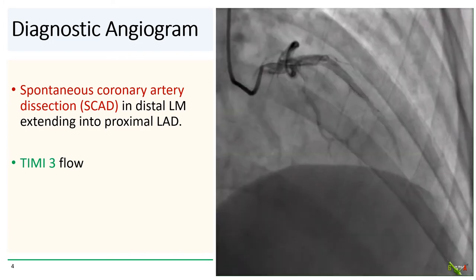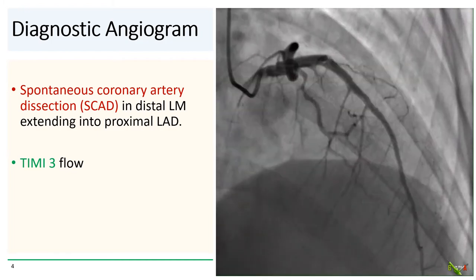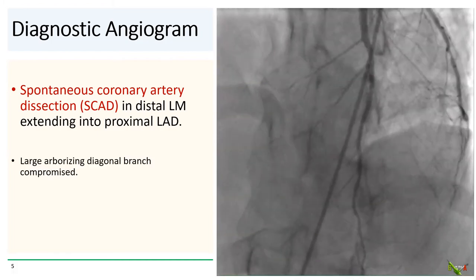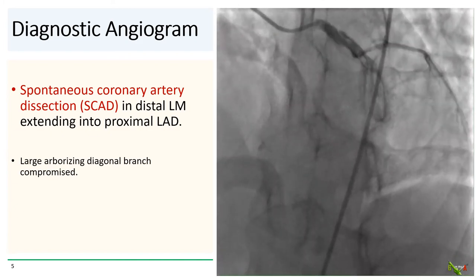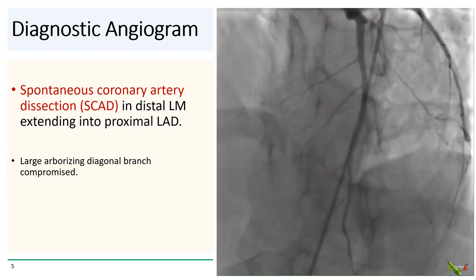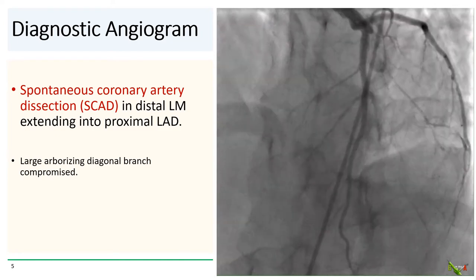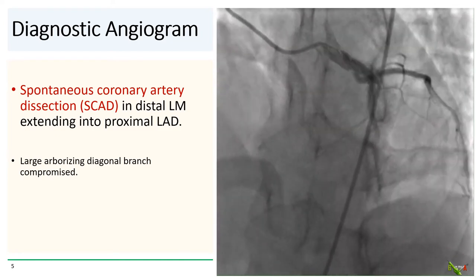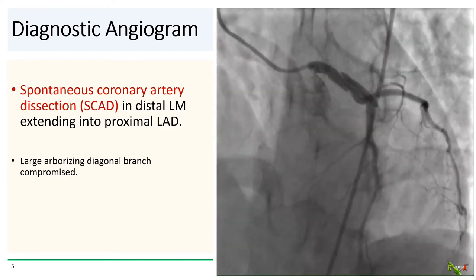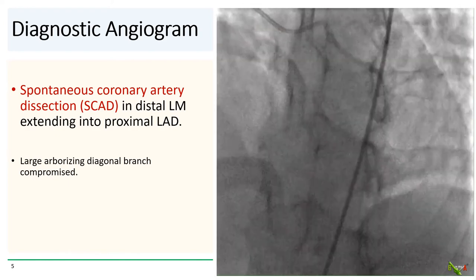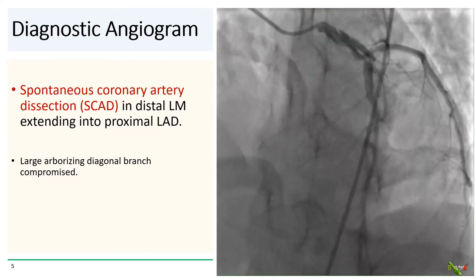Fortunately, there was still TIMI-3 flow down the LAD. Here is another view of the spontaneous coronary artery dissection. In this view, you can see that while there is still good flow in the LAD itself, flow in a very large arborizing diagonal branch has been severely compromised by the dissection flap.